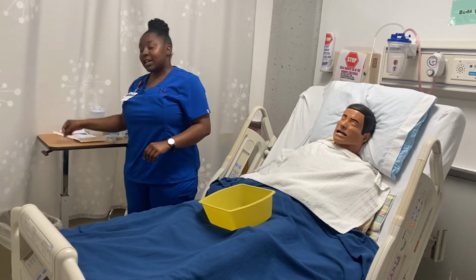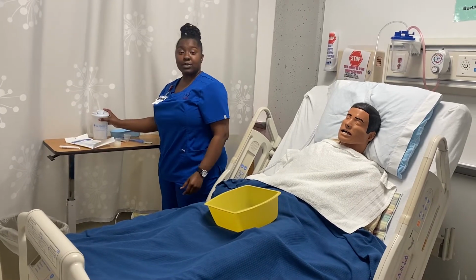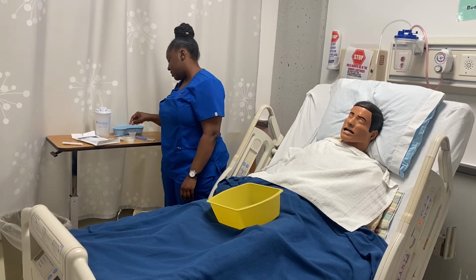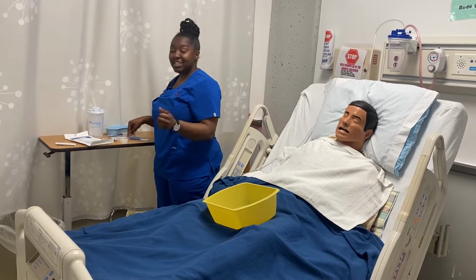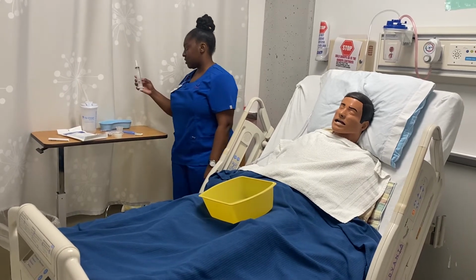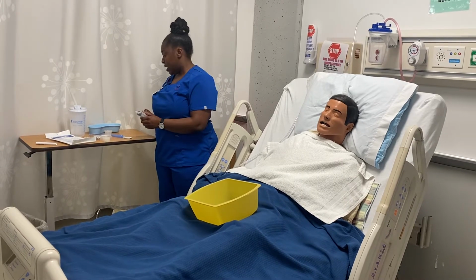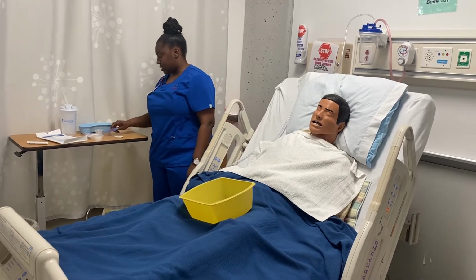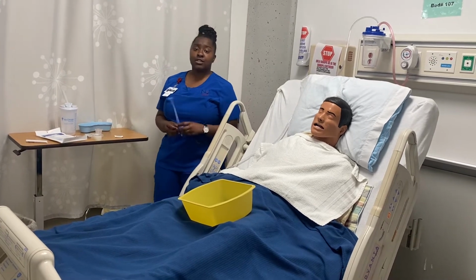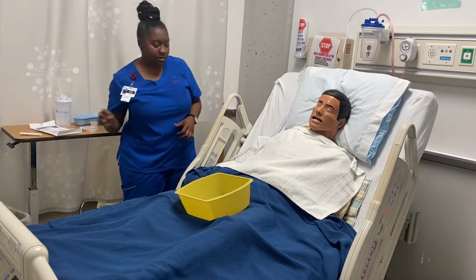Also have my pen light. I also have my NG tube. I also have water for the patient to drink. Some tape. The pH strips, then some lube, and then the syringe to suction some of the acid, and then a suction, just in case the patient is unconscious and might need to be suctioned and stuff like that. So I'm gonna get started.